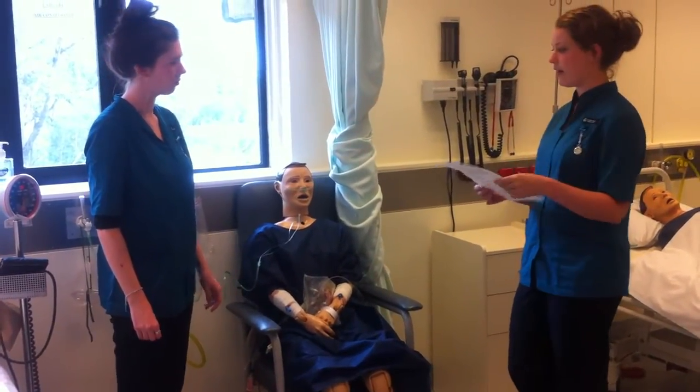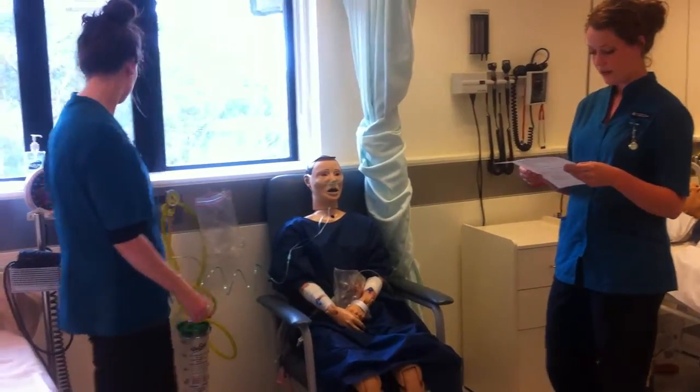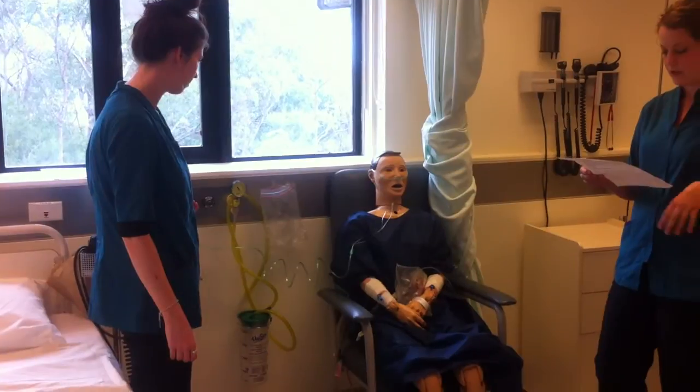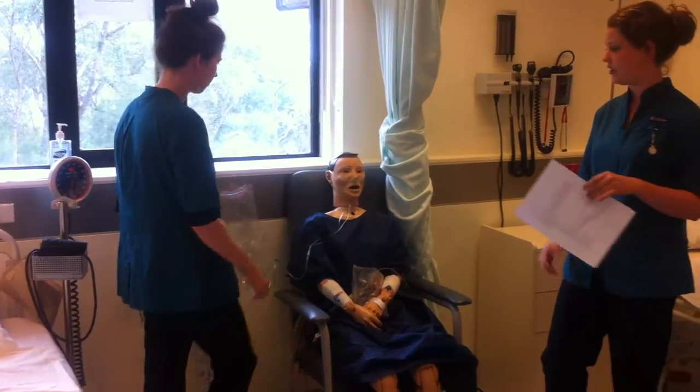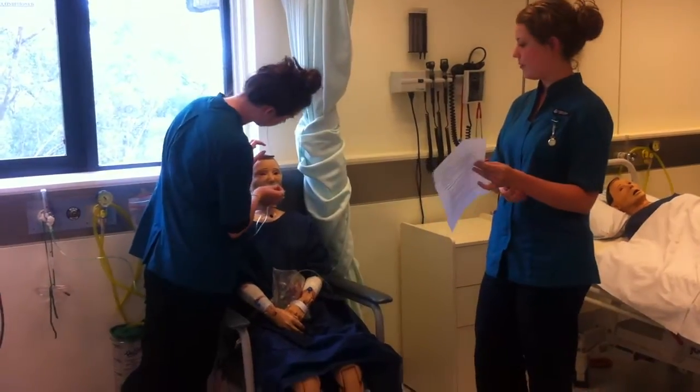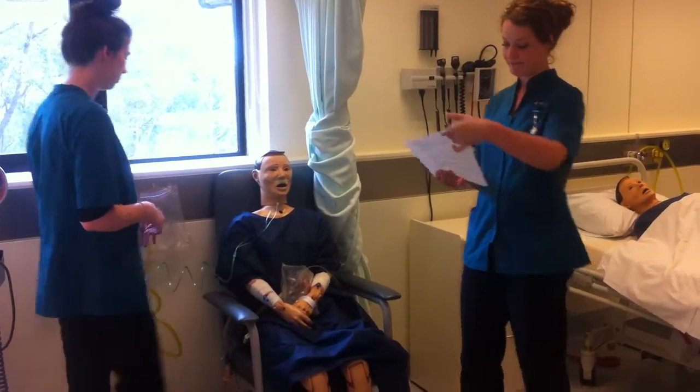The oxygen is provided through the wall outlets or through cylinders. They all need to be checked before, during and after use to make sure they have enough oxygen. Alright, so Penny will now apply the 3 litres.